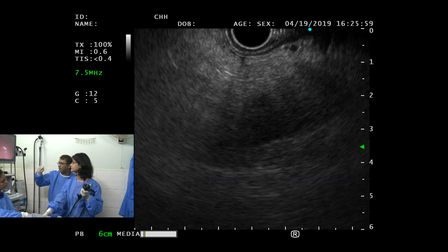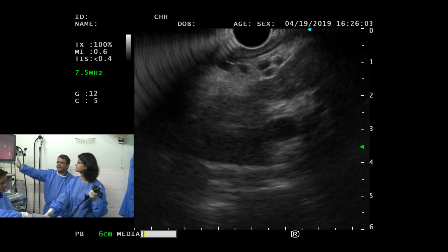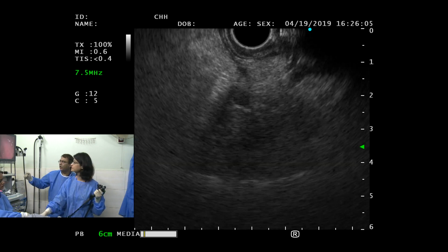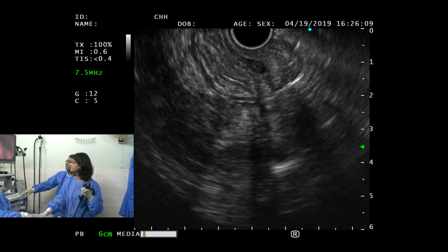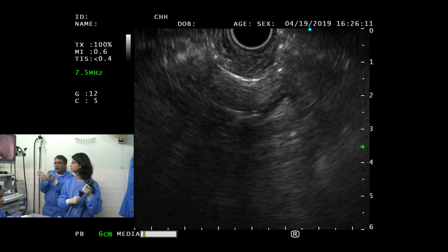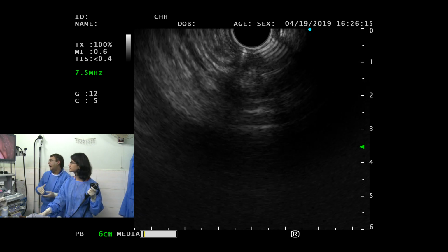So endoscopically, pull it back. When you don't see anything endoscopically, you always pull back, okay? I mean, you will have to inflate. Inflate. And the camera on the EUS scope is at a 45 angle, so just keep that in mind.